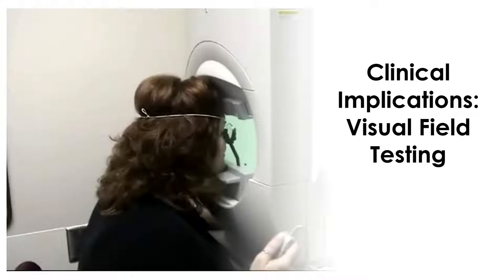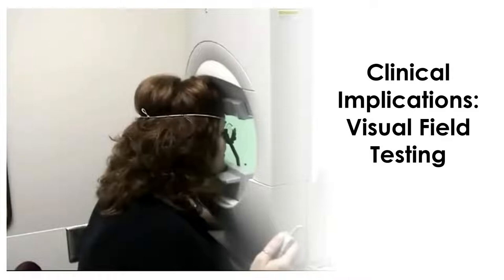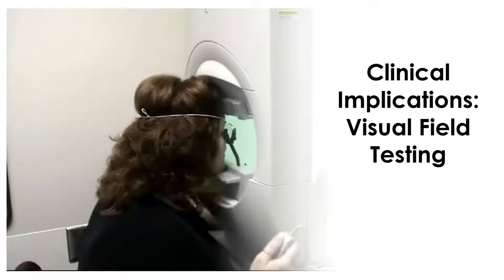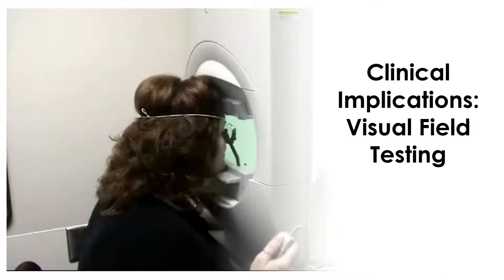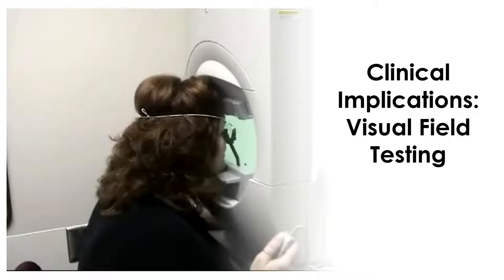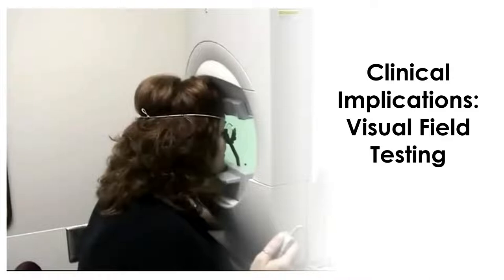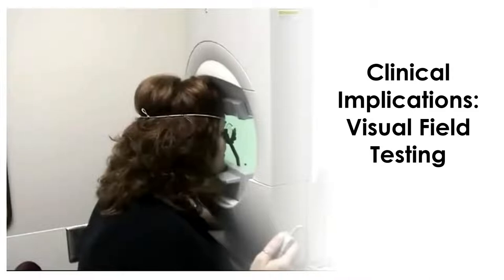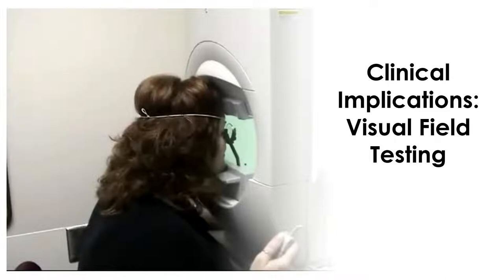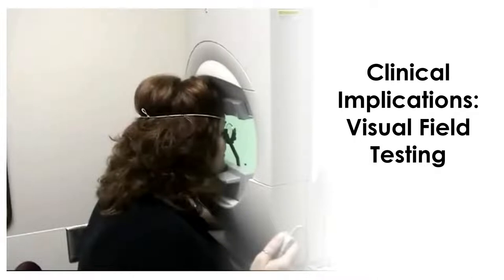The clinical procedure used to map out visual fields is known as Perimetry. Because Perimetry uses light detection tasks to measure the extent and sensitivity of the visual field, what we have learned so far is quite relevant. Modern day visual field testing is the culmination of years of psychophysical findings and methods related to the previous topics. Therefore, we will take a look at some of the psychophysical properties behind the Humphrey visual field analyzer.